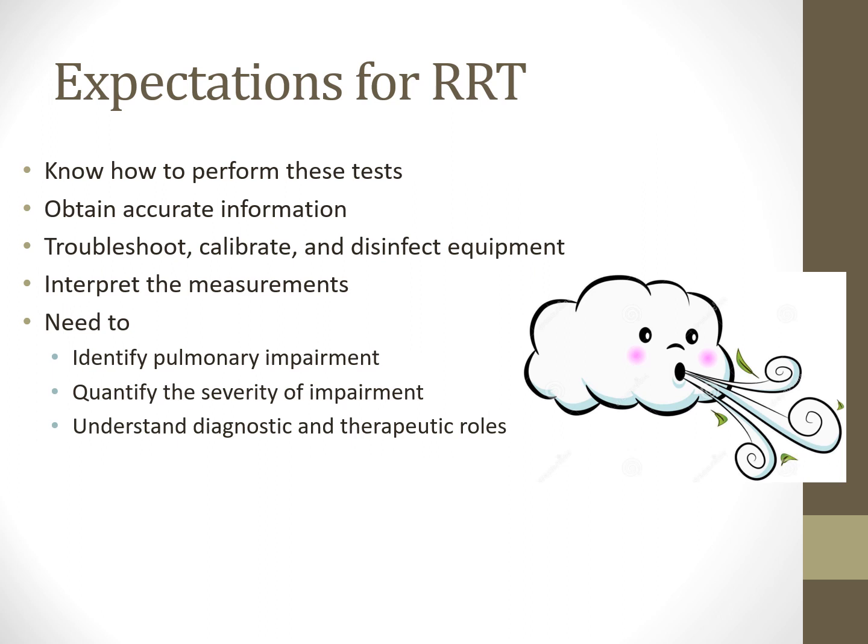So what are your expectations here? The big thing is to know how to perform the test. This is very coaching dependent. Patient effort dependent is the big thing. So that means if it's patient effort dependent, the coaching dependency is there. So you coaching a patient, being excited over this, like, okay, take a deep breath in and blow really hard, keep going, right? Really getting the most effort out of them is important to making sure they get the right diagnosis, the right concentrations of medicine, the right routes. So it's big that you know how to perform these tests, and we'll practice this in course.